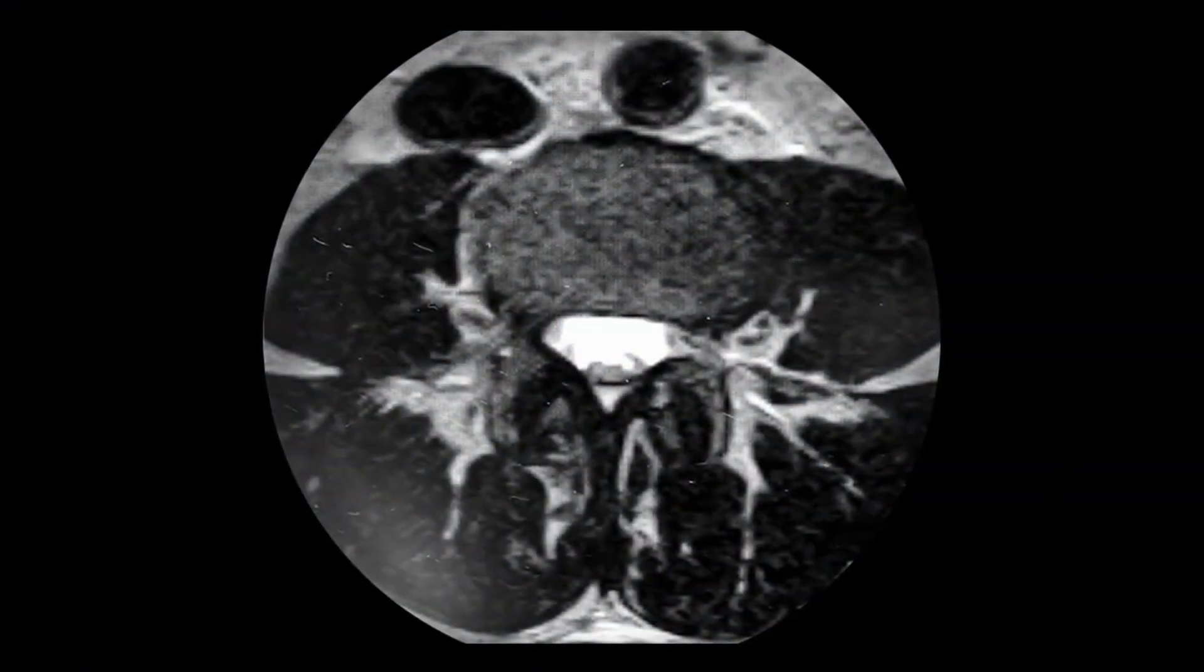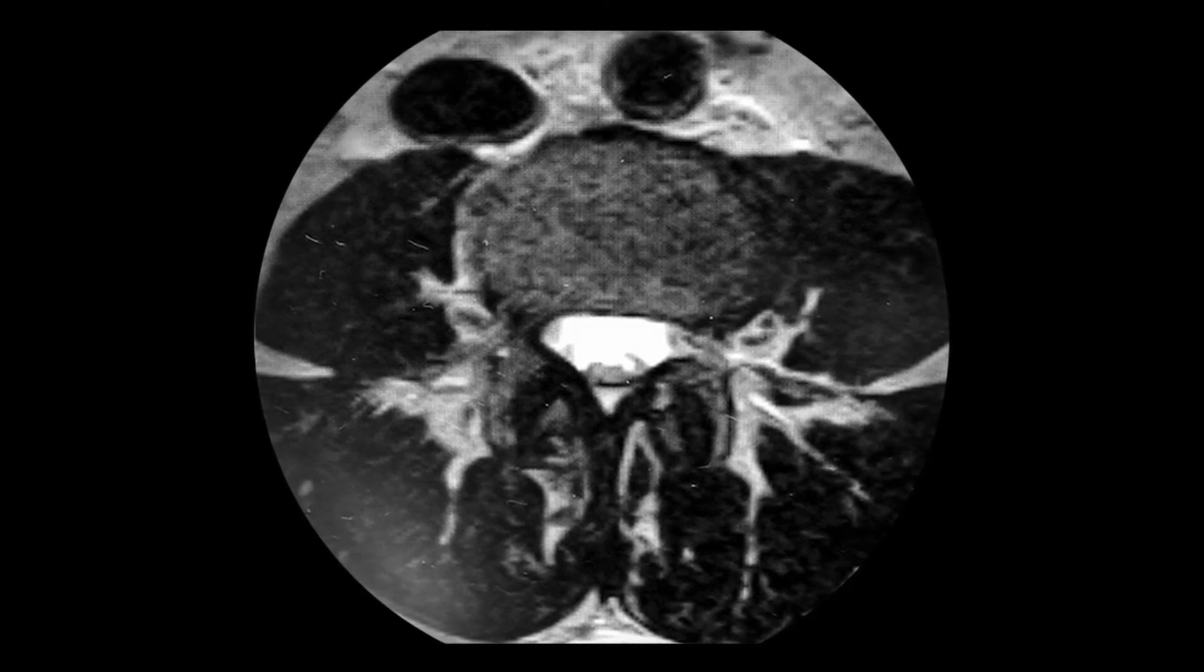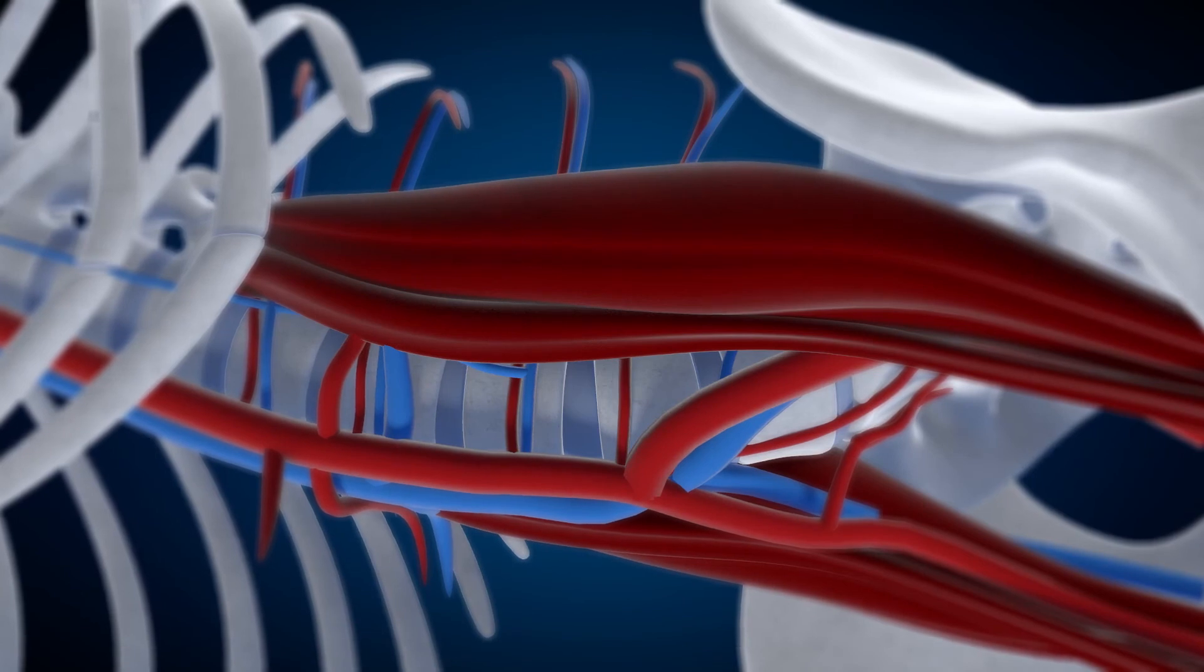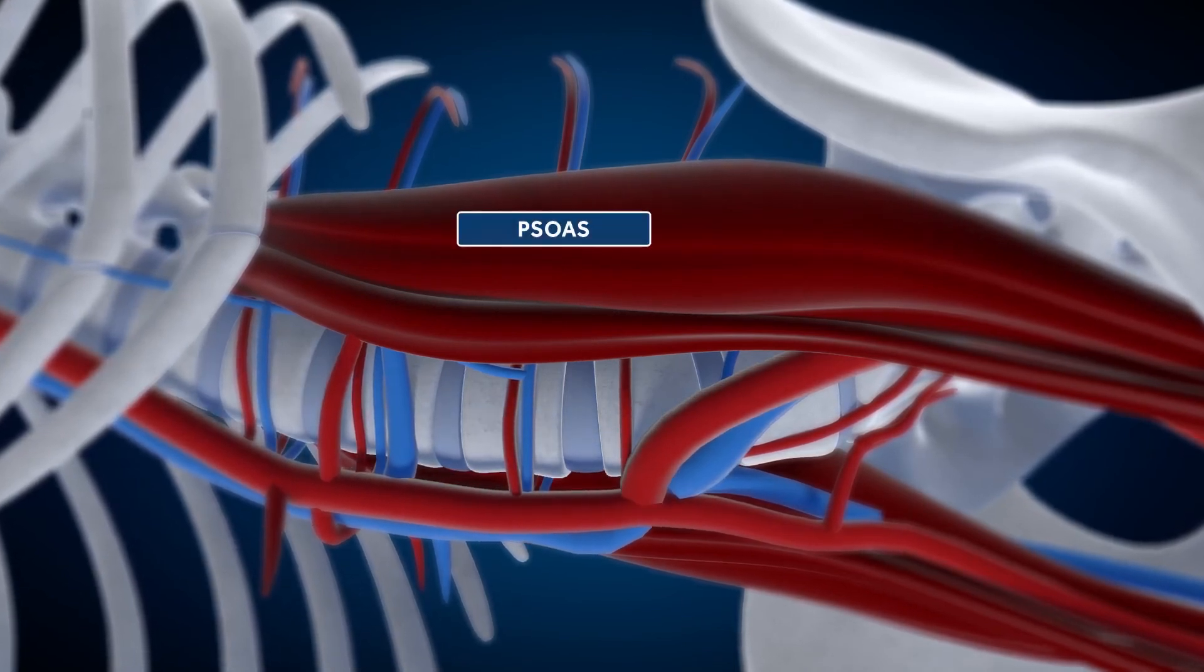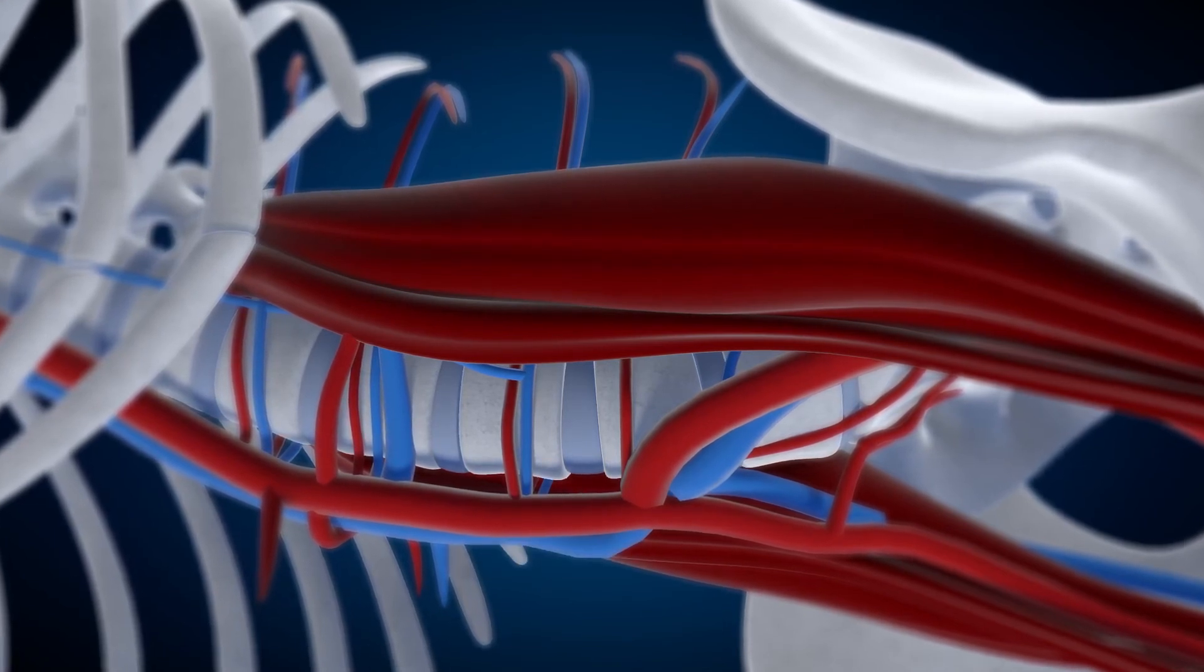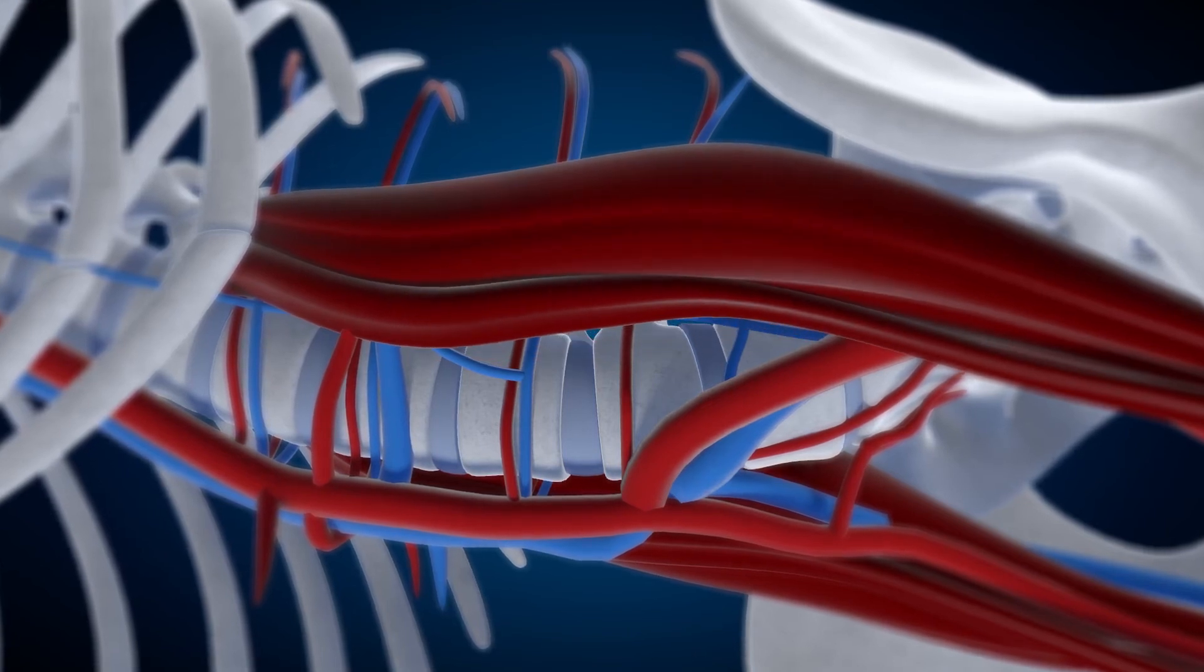In the OLIF-25 procedure, look at preoperative axial MRIs to evaluate for irregular vasculature. Positioning the patient laterally, left side up, increases the size of the corridor between the psoas and aorta as the great vessels move to the right. The preferred starting position of the probe on the disc space is anterior to the psoas and away from the major vessels.